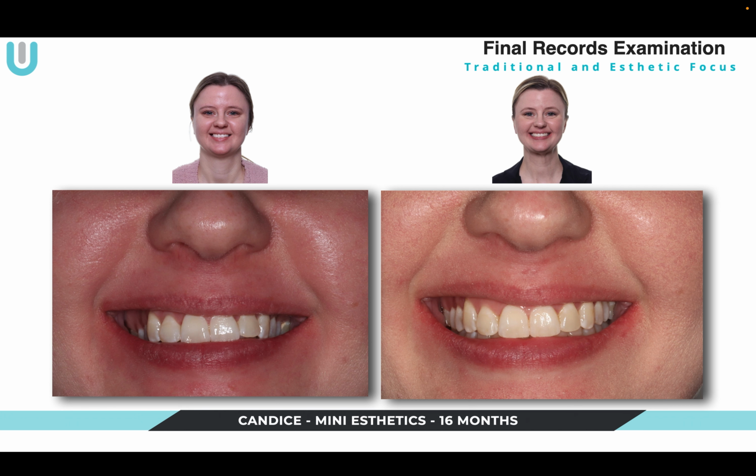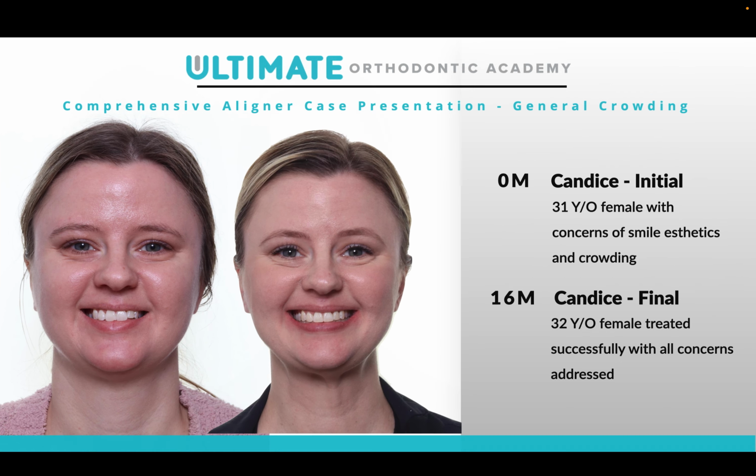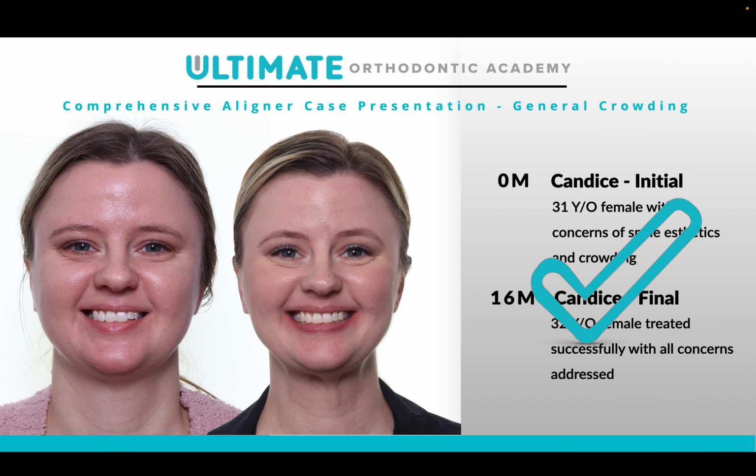She was super happy. And, again, everything kind of worked out beautifully. So not far off track. When you do cases in 3 phases, very distinctly, it's usually 7 appointments. We can do this in 5 if we're using Smart STL, which is a way that we can partner with our monitoring companies to take the refinement scans for us. But anyway, 7 trays, patient's happy.